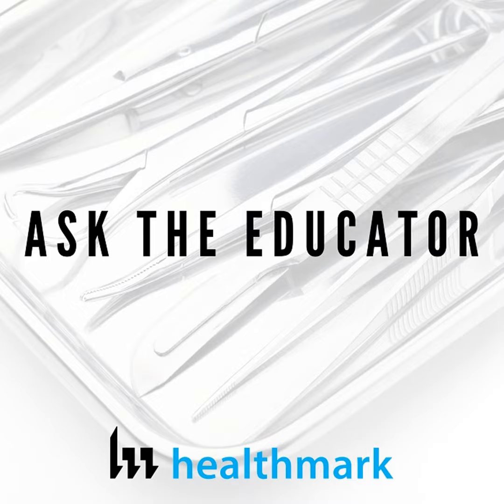And anytime I go into a facility, it's usually one of the first things I ask. Do you guys do arthroscopic shavers? If so, do you have specialty brushes that can clean those arthroscopic shavers? And the answer is almost always no. And then when I go in with a scope or borescope or whatever, I'm seeing dirty stuff. I'm seeing leftover residues, things like that, that unfortunately the brushes that we have, channel brushes, the block style, toothbrush style brushes, those brushes can't clean shavers effectively.